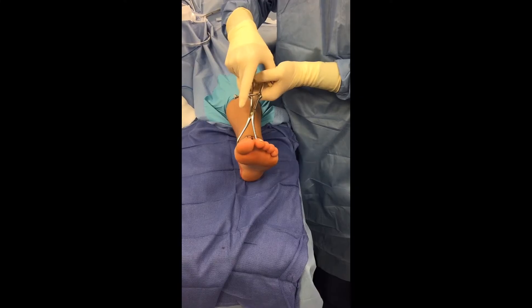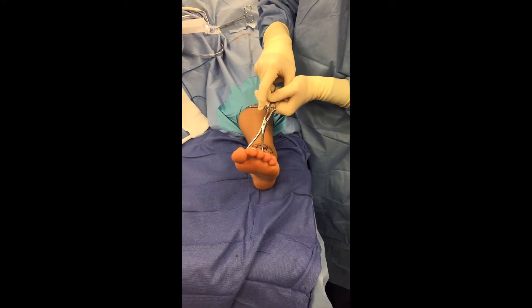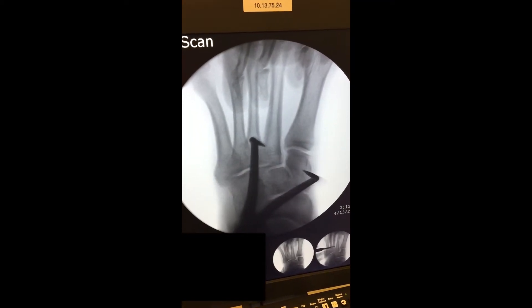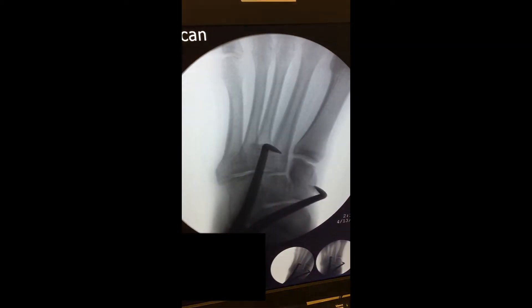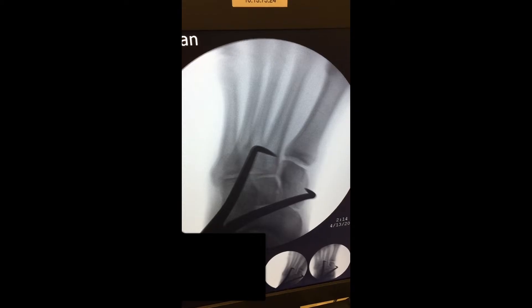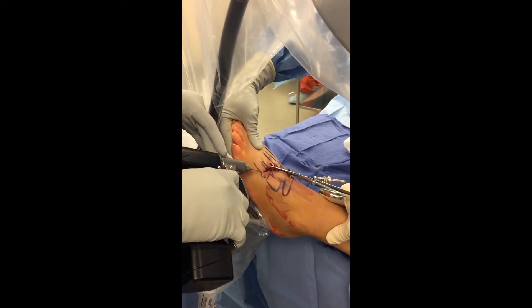In addition, the freer elevator can be used to plantarly depress the second metatarsal, which may be dorsally subluxed as part of the dislocation. A reduction clamp is then inserted through small incisions across the Lisfranc articulation between the second metatarsal base and the medial cuneiform. This is gently squeezed and tightened until the fracture is anatomically reduced.